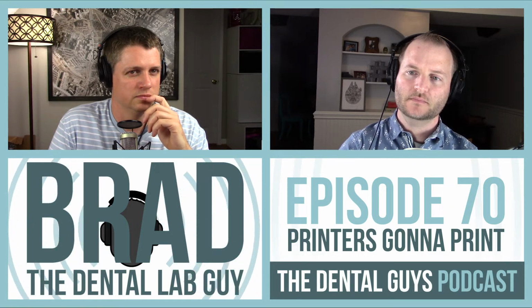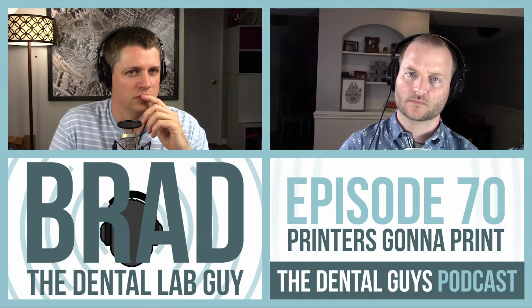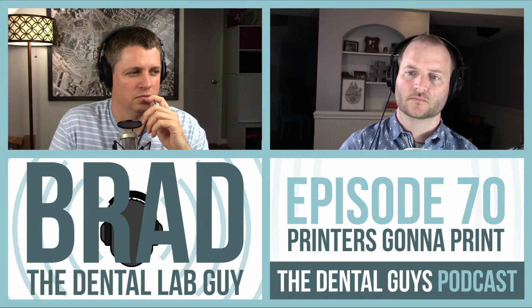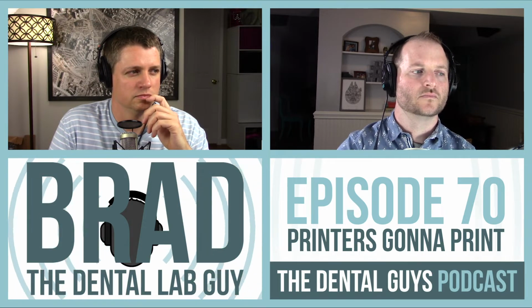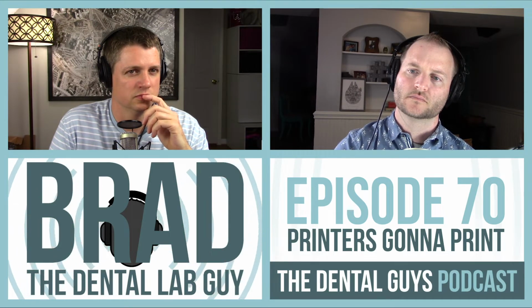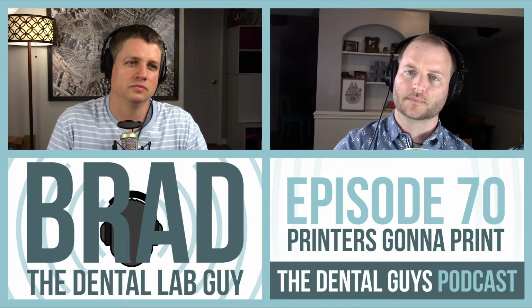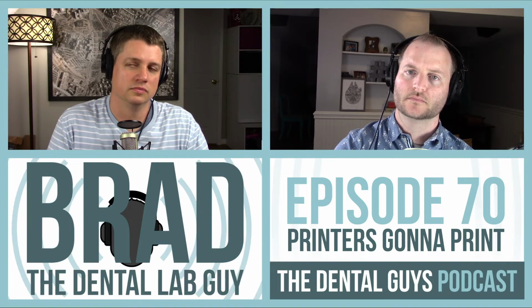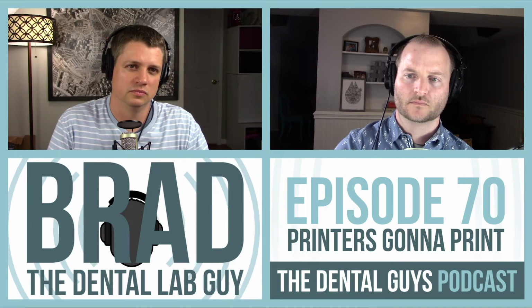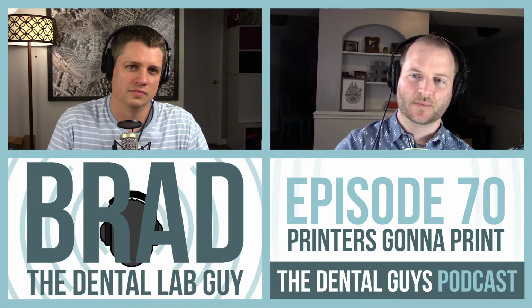Now, gentlemen, the most limiting factor to 3D printing right now is product development in materials. That's really where our limiting factor is. I think the technology is getting a lot better, but like denture-base resin, there's one FDA-approved printable denture-base resin that I know of. I know there's a bunch supposedly in development. Either they're caught up in FDA or they're not developed yet or working on it. Same thing with occlusal mouth guards. There are very few, if any, products that you can print that are FDA approved there.